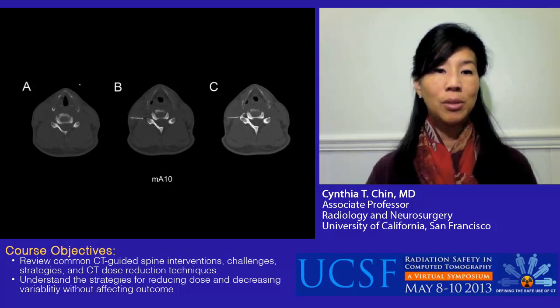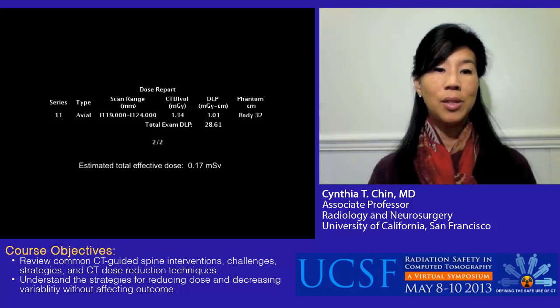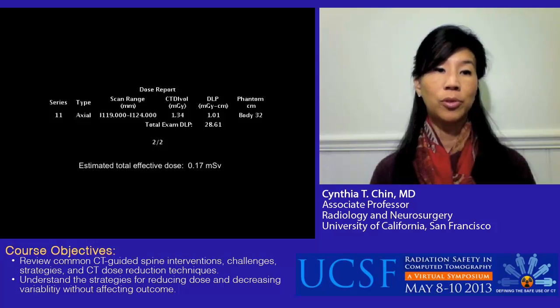And in this particular patient, the dose, you can see, is quite low, less than 30 DLP. And this is equivalent to an effective dose as low as 0.17 millisievert. This is a dose that is equivalent or lower than what has been reported for fluoroscopy-guided procedures.